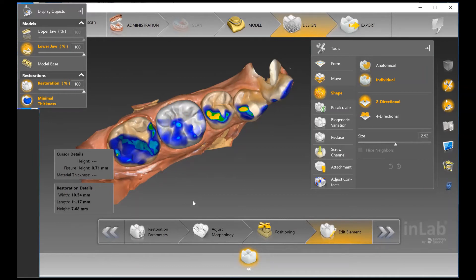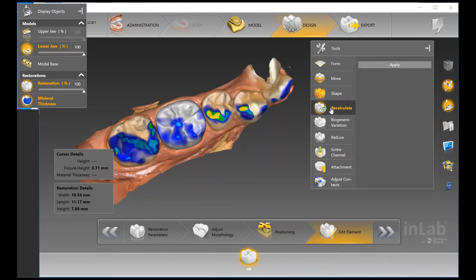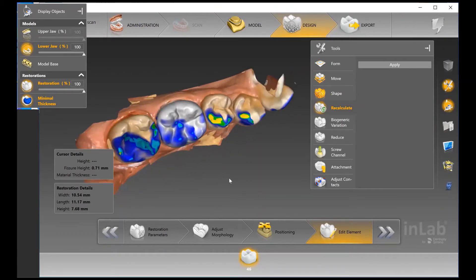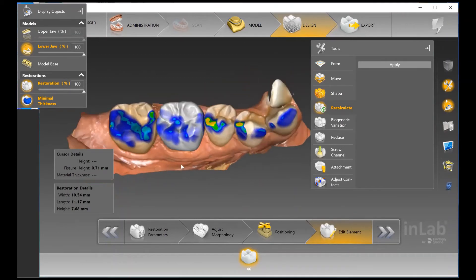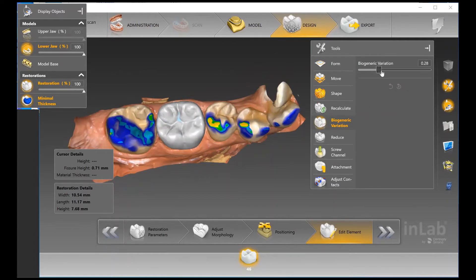When it comes to adjusting the tool size, you can use the arrow on the right-hand side, or as a shortcut, hold your right cursor and move your mouse up and down — that will also change the size. With the Recalculate option, you can basically generate a new design. Biogeneric Variation is rather unique to this software — you can go through a large tooth database of morphologies to settle on one that you like best.